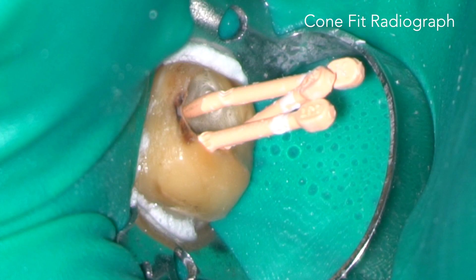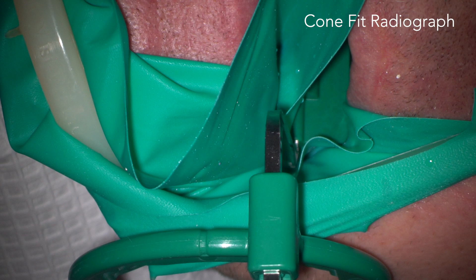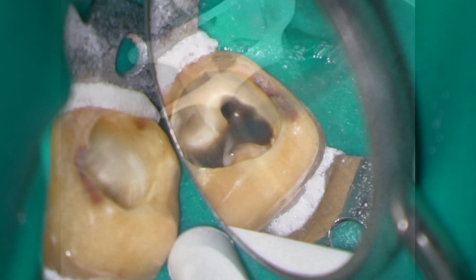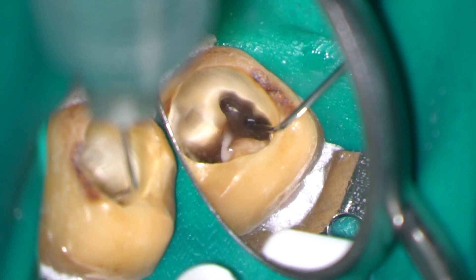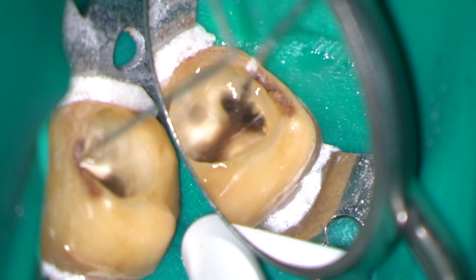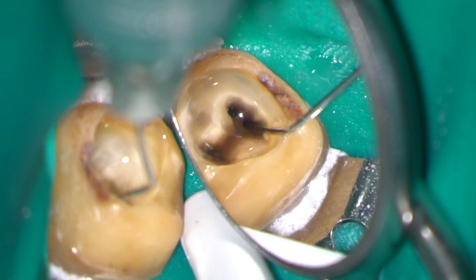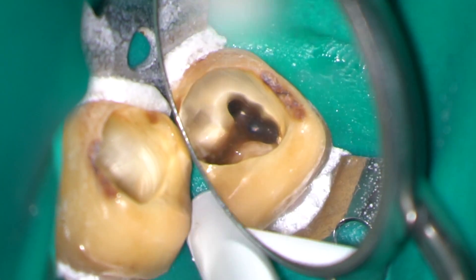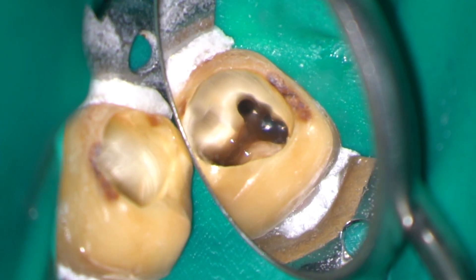I carried out my primary cone fitting with irrigant in the root canals and exposed a cone fit radiograph with the RIN holder. This showed good length in all the canals. The irrigation sequence was completed with 17% EDTA and 3% sodium hypochlorite. You can see convergence in the mesial canals.